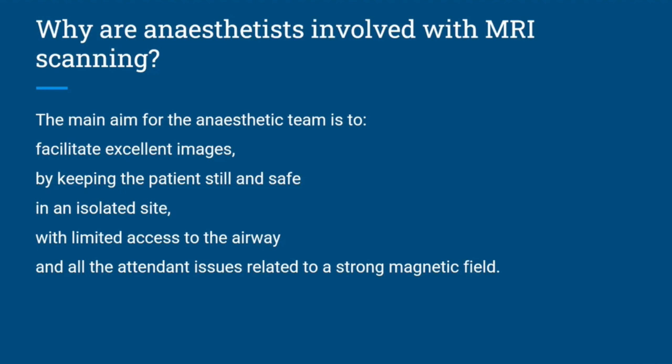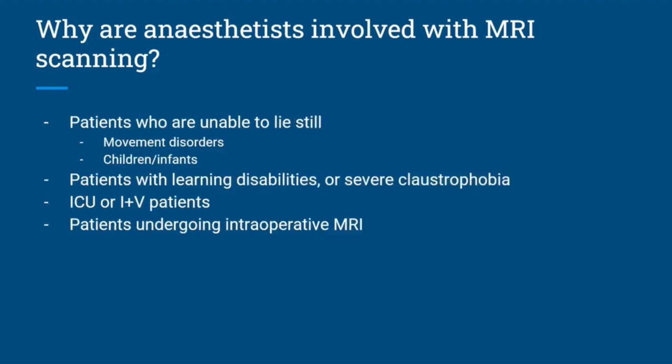It's a bit of an isolated site often, and with limited access to the airway when the patients are within the MRI scanner, because they're in a magnet but also constrained physically, and there are multiple issues relating to the magnetic field. So I try to cover each aspect of this for this presentation.